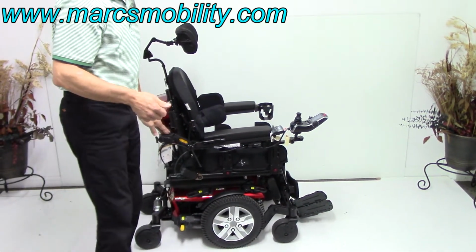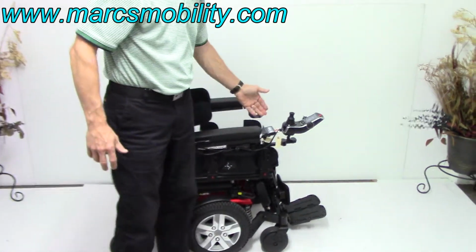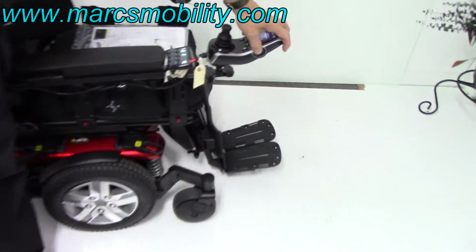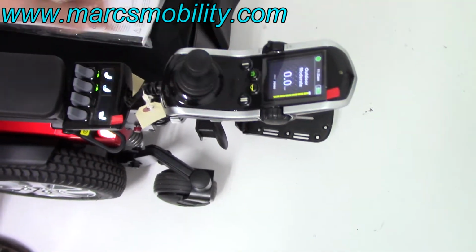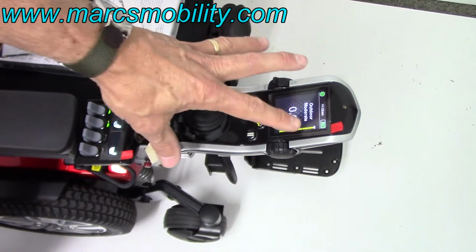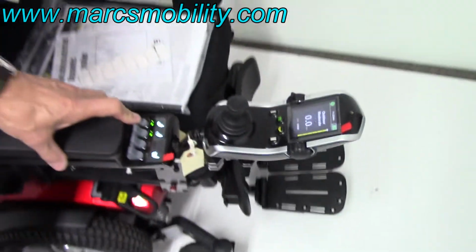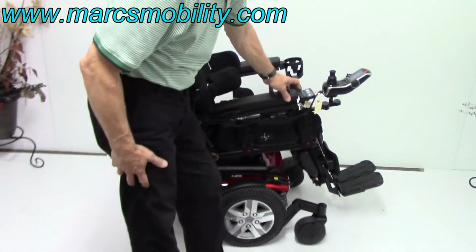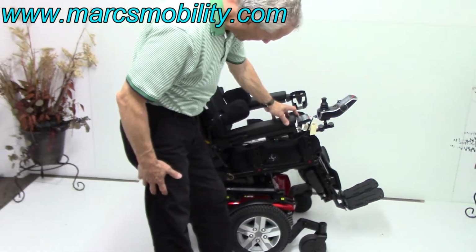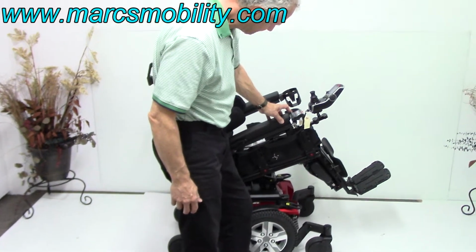So the first thing I'm going to show you, it has other features too, but we're going to cover the electric tilt. You can do everything through the joystick right here, and you can see the stickers are all still on the boxes, all the stickers. You can do all the function through the joystick or through the switch box. The first one will be the electric tilt. So if I push this button back, I have my electric tilt going back on my chair. And this will be the electric tilt.